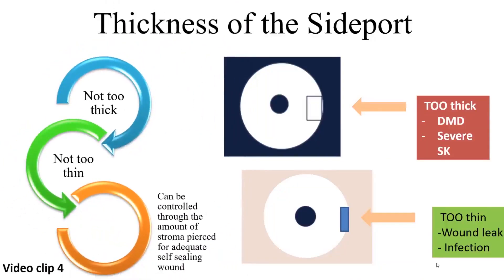The thickness of the side port is also important — it should not be too thick or too thin, and it depends on how much corneal stroma is pierced. If too thick, Descemet's membrane detachment may occur, or severe striate keratopathy can happen due to endothelial touch. If too thin, wound leak is more common and can invite infections postoperatively due to poor wound healing. The thickness can be controlled through the amount of stroma pierced for adequate self-sealing wound.